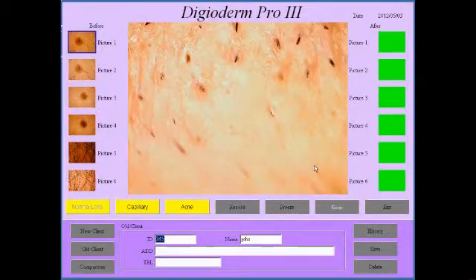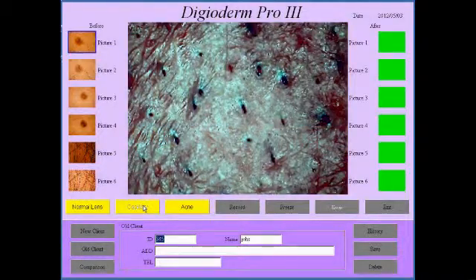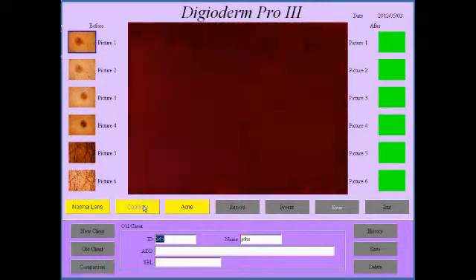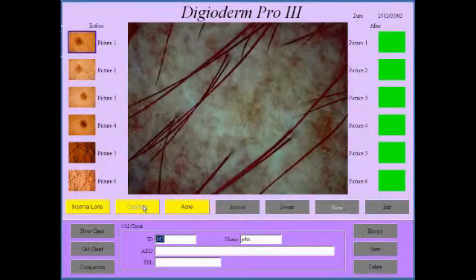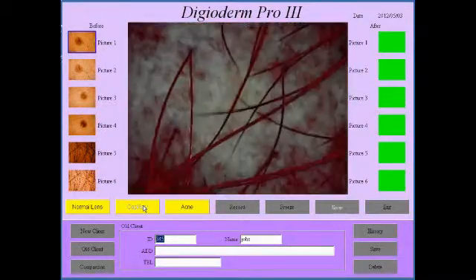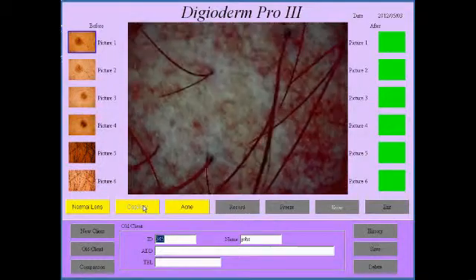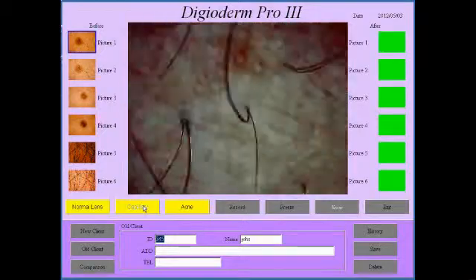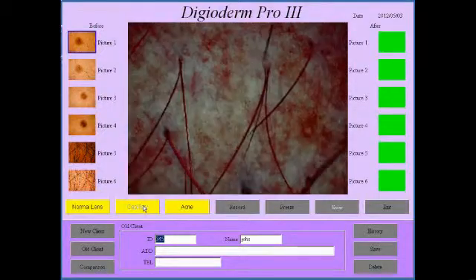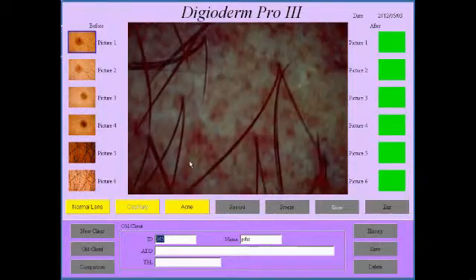I forgot to show you the capillaries view of this — so if I hit capillaries, you can see what it does: it starts giving you the underlying capillaries. And once again you can set the contrast and brightness to bring up the capillaries for you. I believe this is also very important to see whether a nevi or malevolent cancer is being fed by the capillaries.